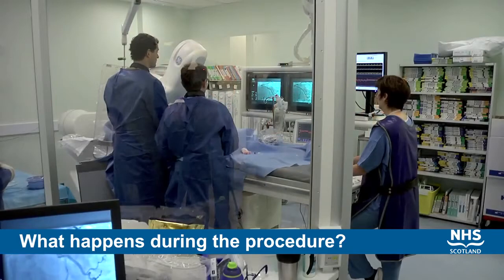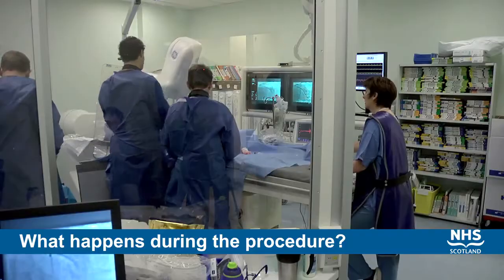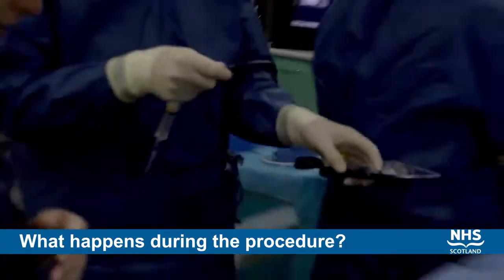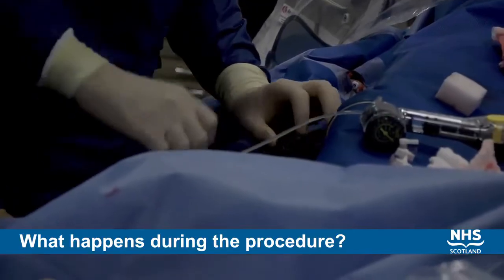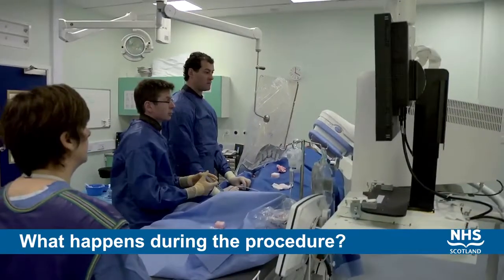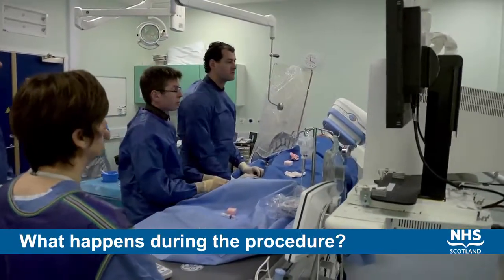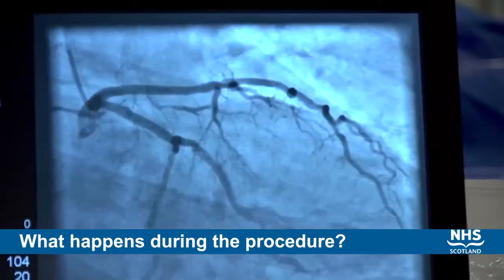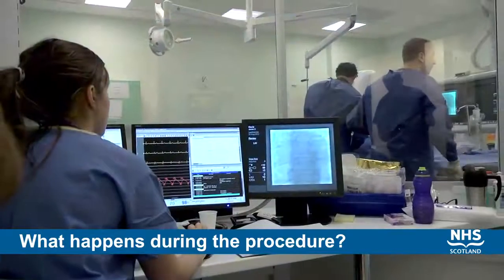We have the option during the procedure of investigating the narrowings more closely using a pressure wire. This may involve passing a very fine guide wire across the coronary artery narrowing and administering a test drug called adenosine, which will result in a degree of flushing or chest tightness that is very short lived and only lasts a few seconds.